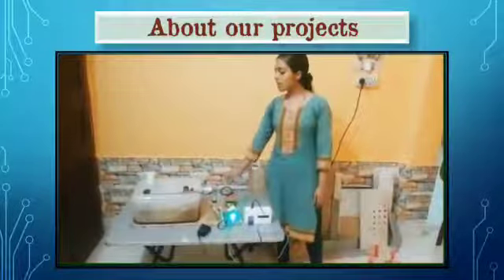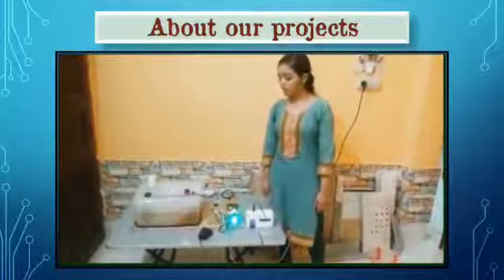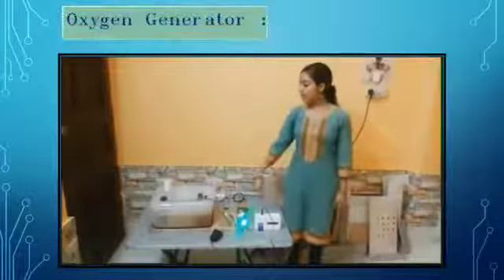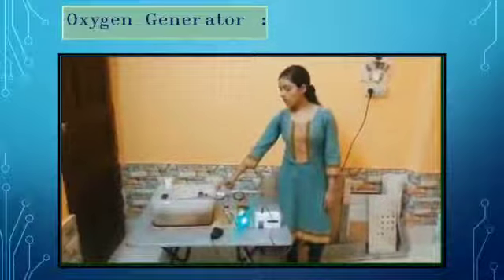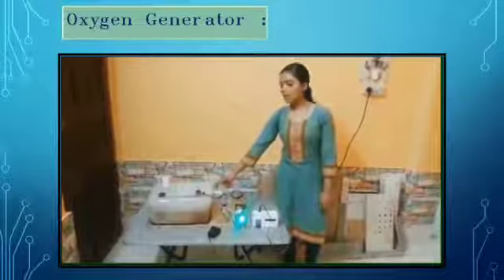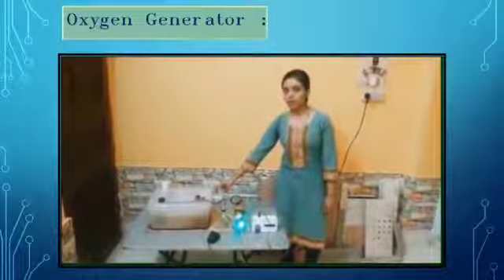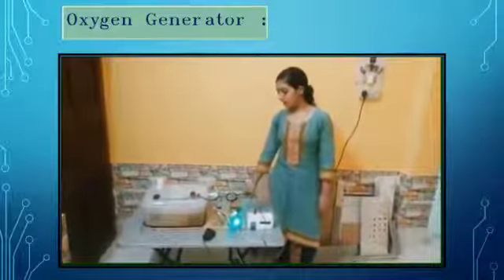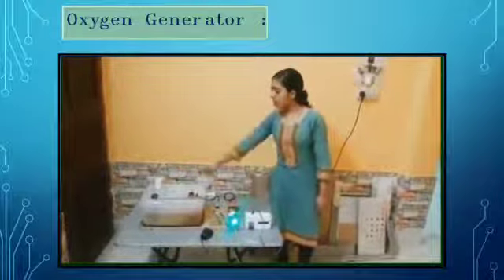In this oxygen generator, oxygen is generated with the help of electrolysis of water. This is a 10-liter container which has water inside. Sodium bicarbonate is added to the water to aid in the process of electrolysis. And here, a stable DC power supply is used. This is a ball cork used.